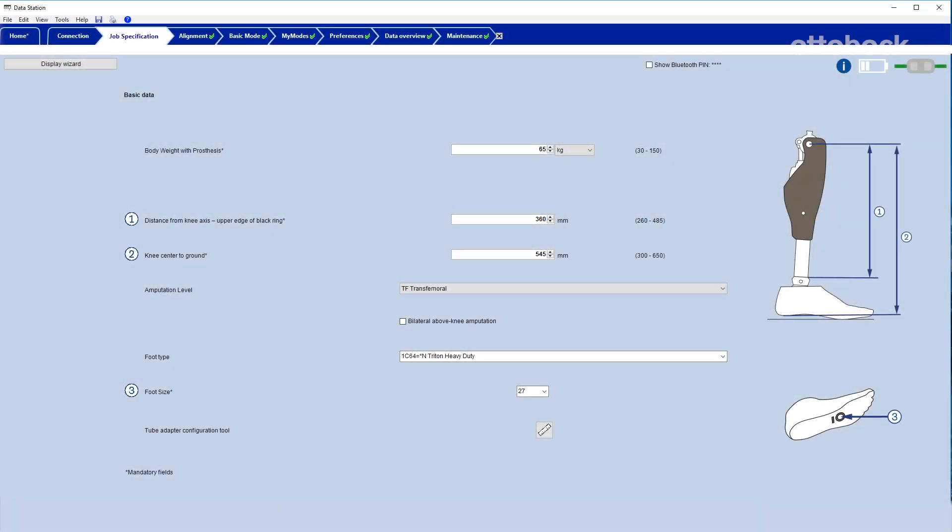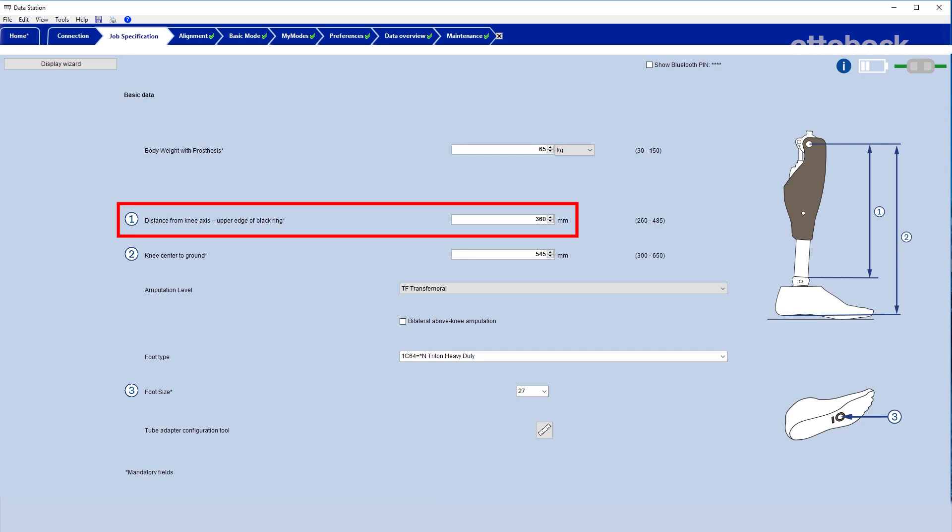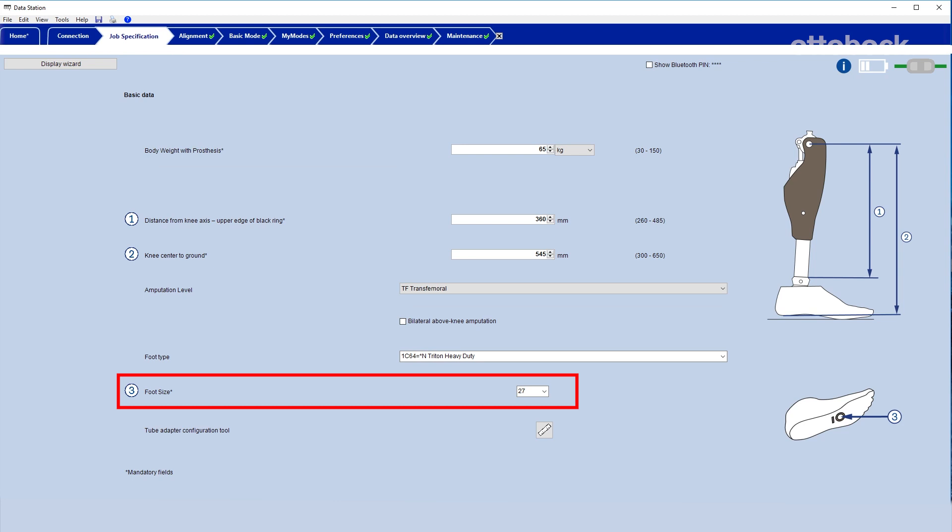For Genium and Genium X3, additionally measure the distance from knee center to black ring. Enter the value as well as the foot size into X-Soft.